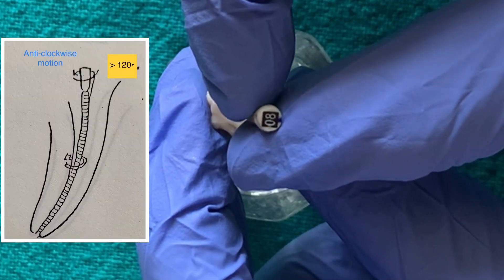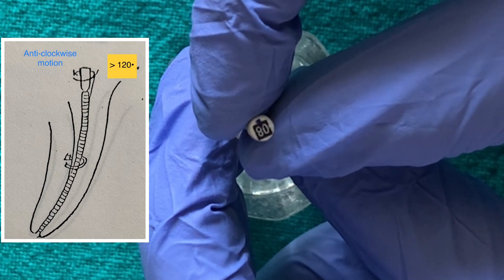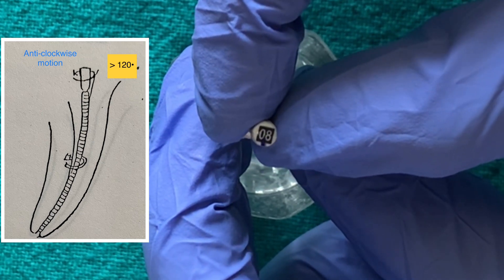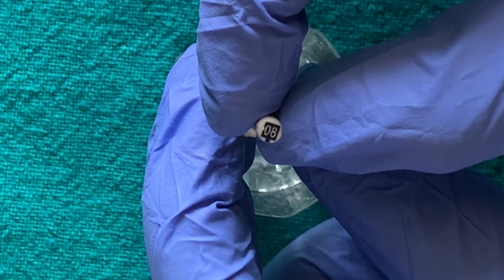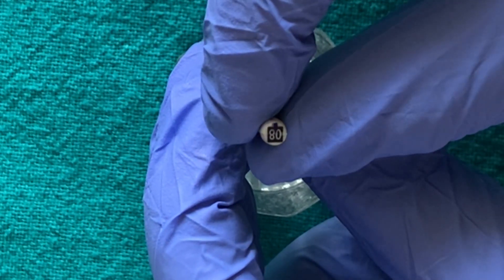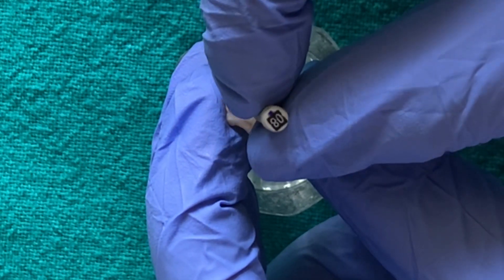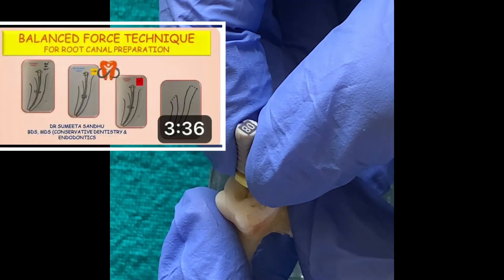In the next action, we move the file in an anti-clockwise direction from 120 degrees to a maximum of 270 degrees, and we use inward pressure while moving in this direction. With gentle oscillations in right and left directions and light inward pressure, the instrument is carried gradually to the working length.